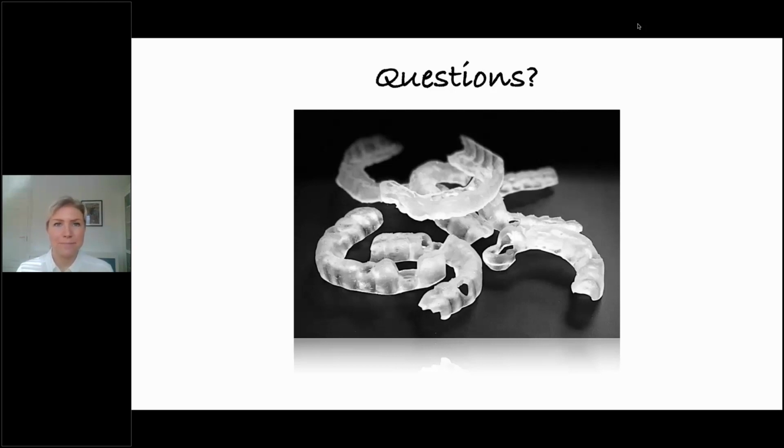I find that to be the most difficult, especially with complex multi-unit aesthetic cases. Those are high stakes, and we need a lot of information in order to tie those together. I've shared some of the strategies that we use for accomplishing those. I think critical steps are emerging, obviously the intraoral models with the CT, but with the experience I have, I don't really have much problem with that. And there's a learning curve to doing every step of the way, even the 3D printing. Planmeca makes a 3D printer that's pretty much plug and play, which makes it a lot easier, the Creo.